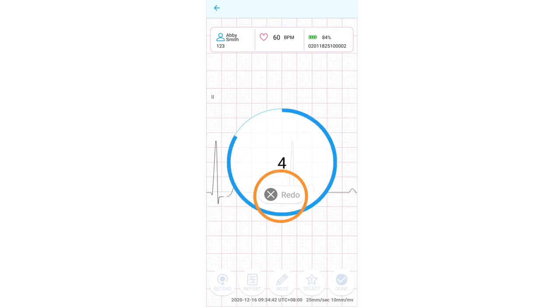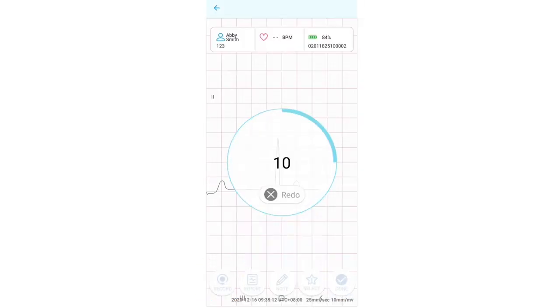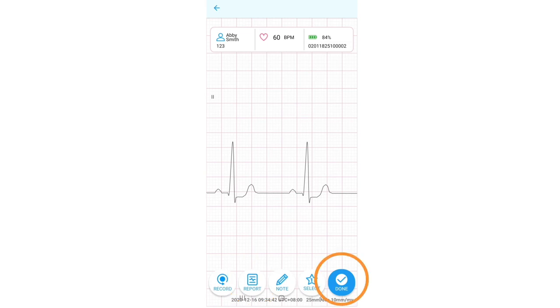If you press the redo button, it will start another 10-second recording. When the recording is done, it will automatically start processing. Once completed, press OK. You may press the note button to add a note to this recording. Press the record button to make another recording. Press report to view the PDF file of the last recording you have done. Press done when you are done recording.